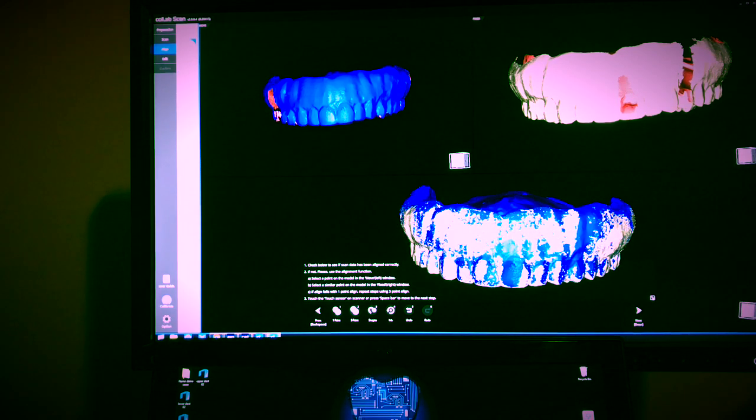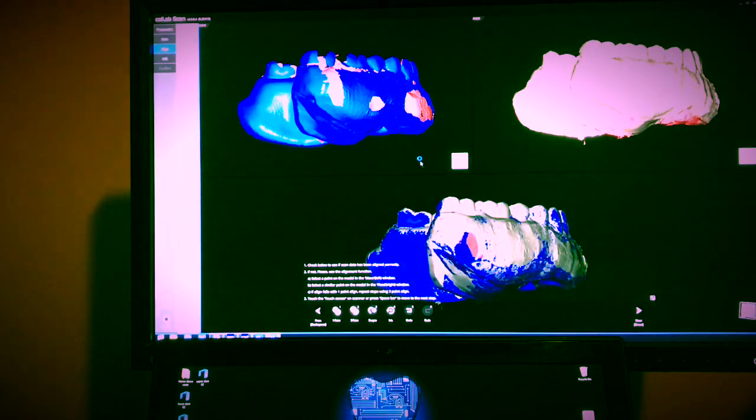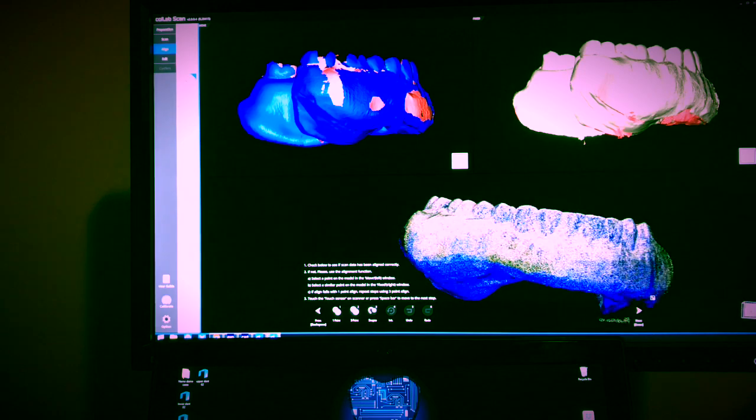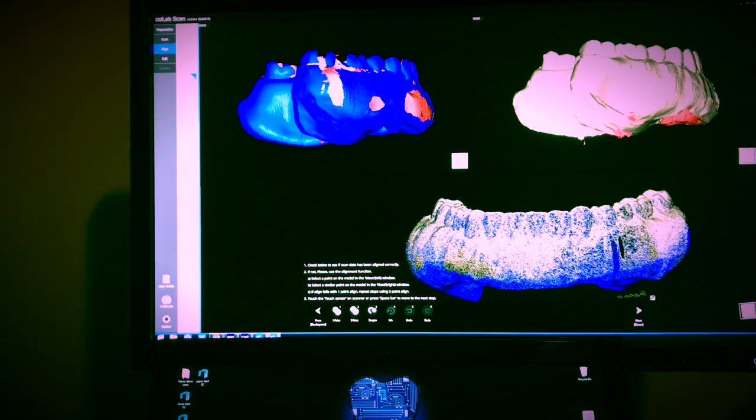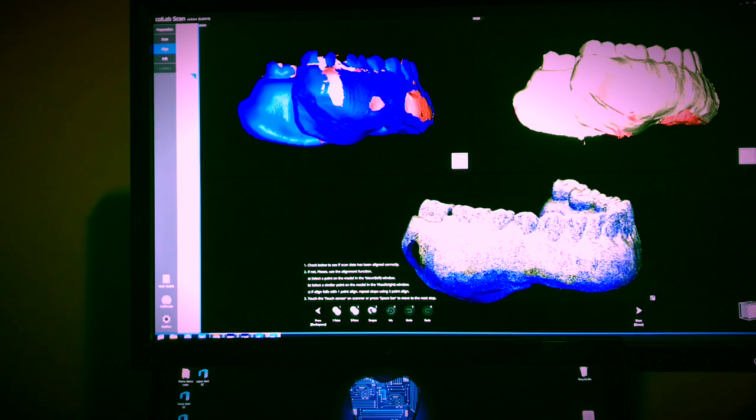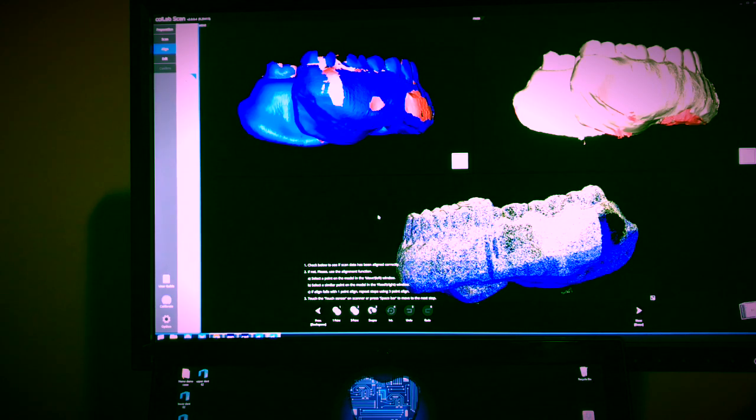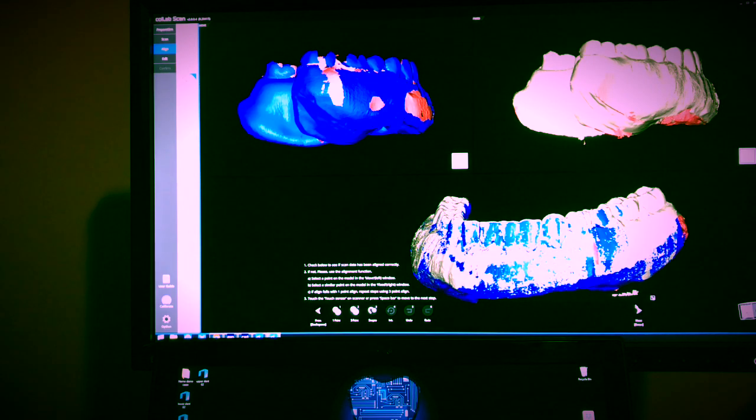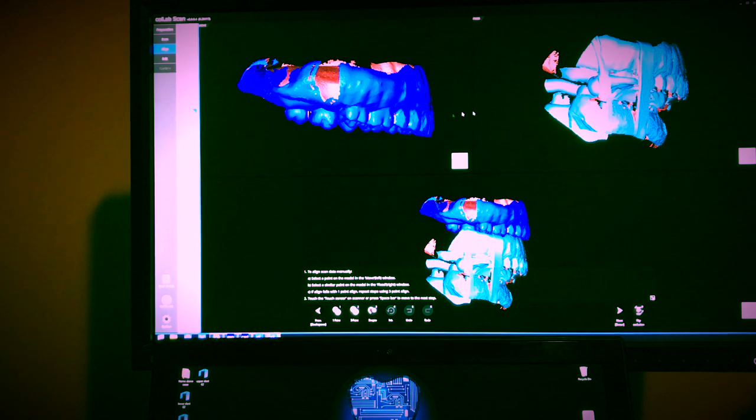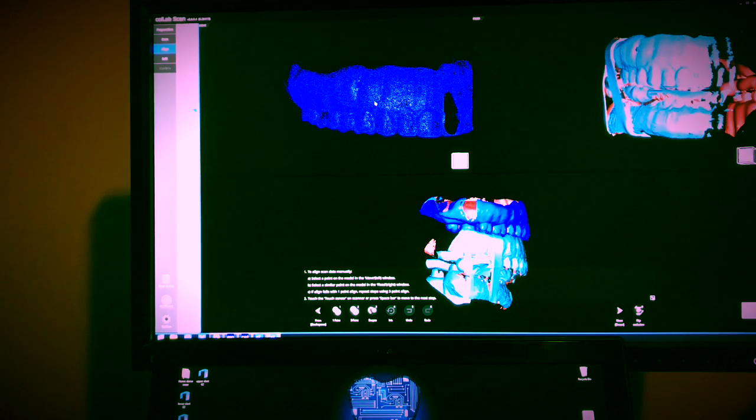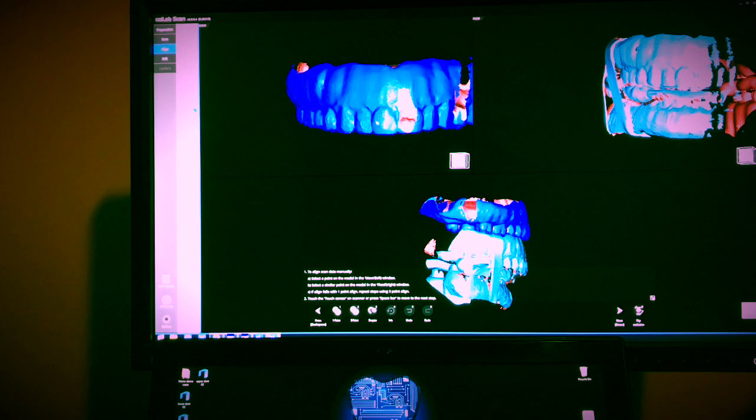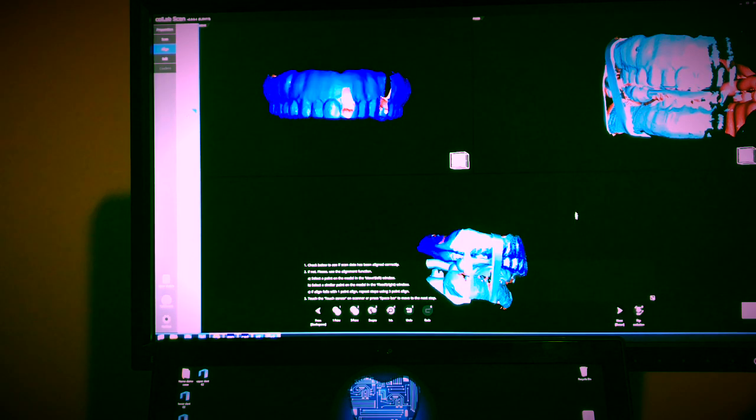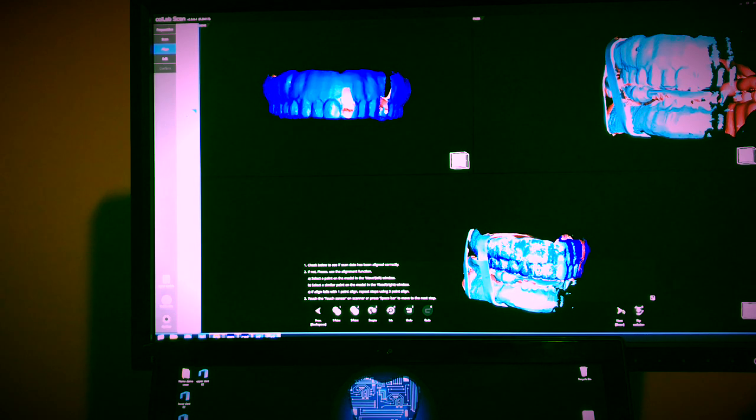Now from there you do the same thing for the lower. This one is already aligned. Sometimes the software just recognizes the best fit, and it's done. So I click next, and now I have a bite record here, so I'm just going to align the upper one to the bite. Done, easy. Next.